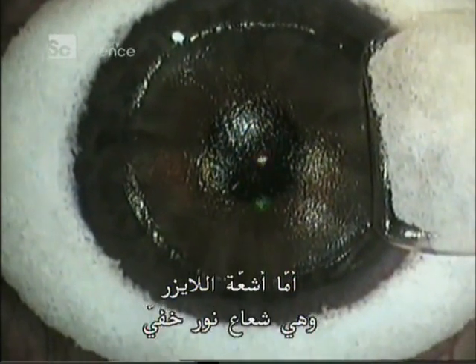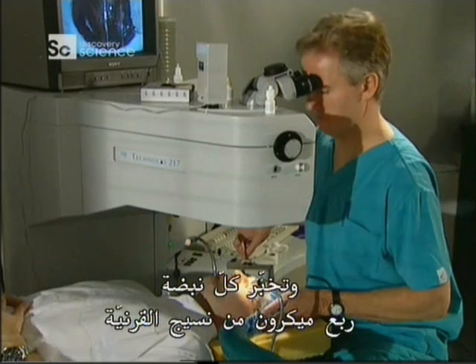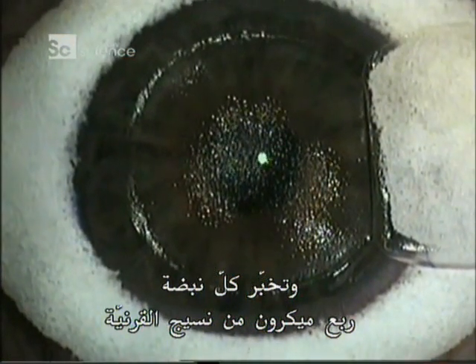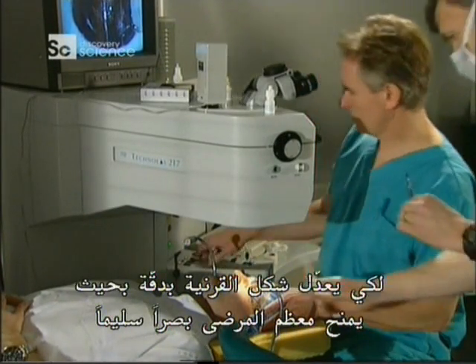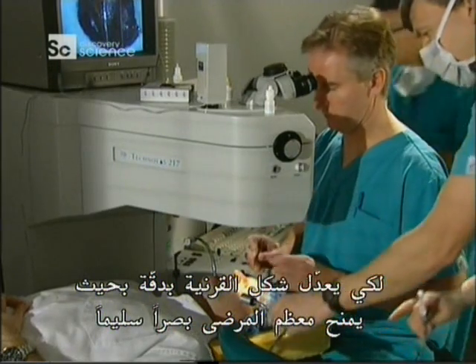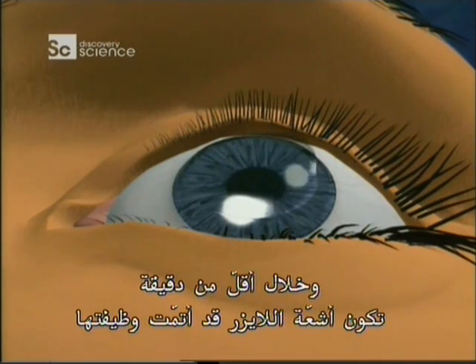The laser — an invisible beam of light — fires at 50 pulses per second. Each pulse vaporises one-quarter micron of corneal tissue. The laser is controlled by a computer program, so it knows exactly how to reshape the cornea to give most patients 20-20 vision. In less than a minute, the laser has done its job.